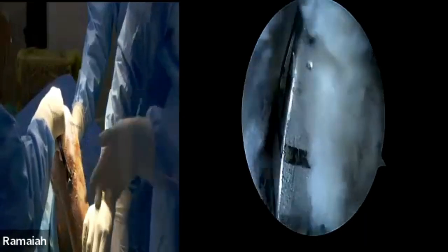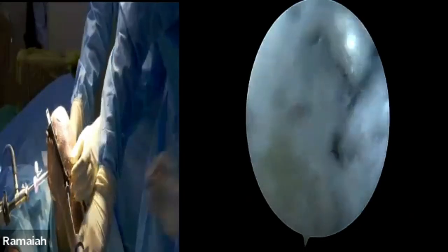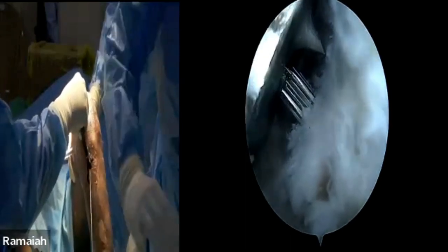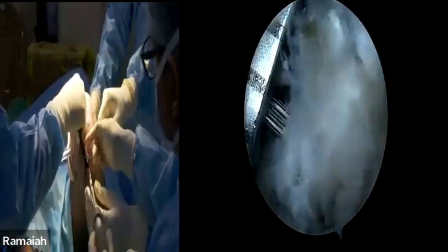Question: do you place the tibial jig between the PCL and the tibia, or on top of the PCL? Answer: you place it posterior to the PCL remnant, because anteriorly you can't retract it without destroying it. If the PCL is absent or significantly torn, you could go between the remnant and the tibia. But most of the time the whole PCL is intact, so you go posterior to it.